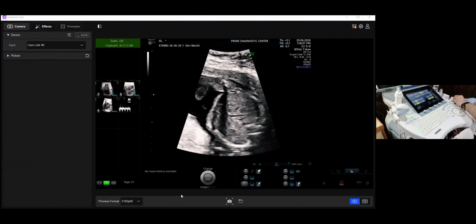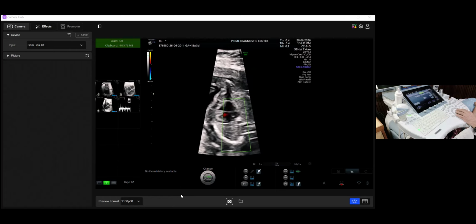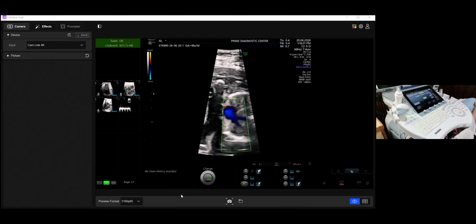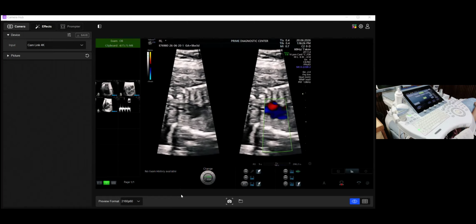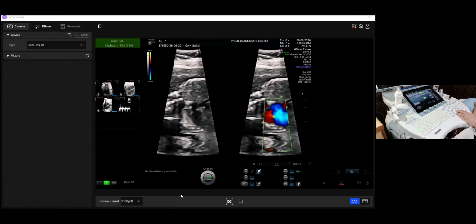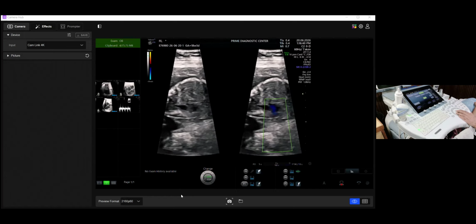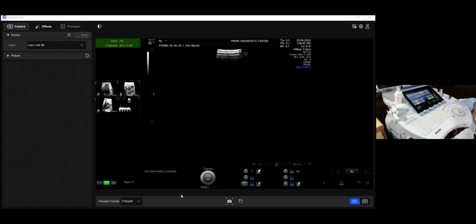You try to reduce this, and let me put the color Doppler on, and now I'm focusing on the descending aorta, and I'm getting it in the middle, and I'm rotating the probe now 90 degrees to get the aorta. Yeah, so that's an ascending aorta. I would have to make some adjustments to get a proper aortic arch. So give me some time because the baby has moved.